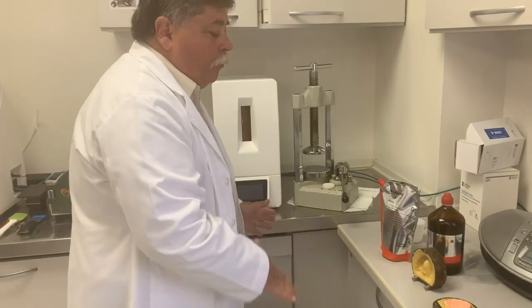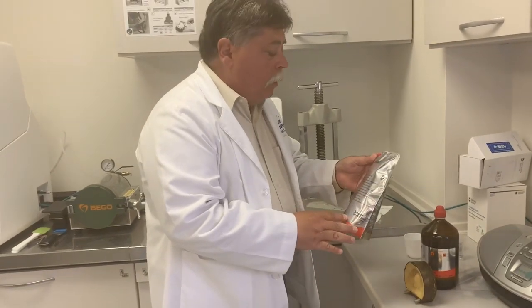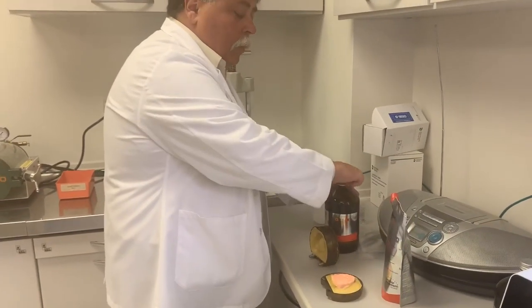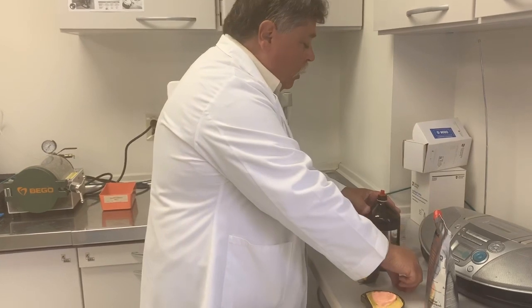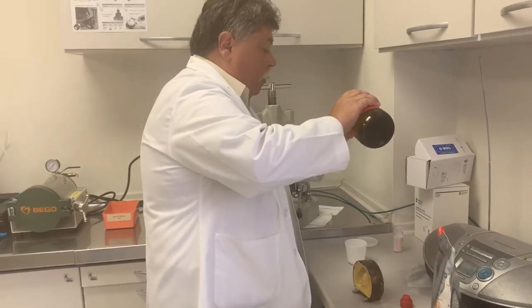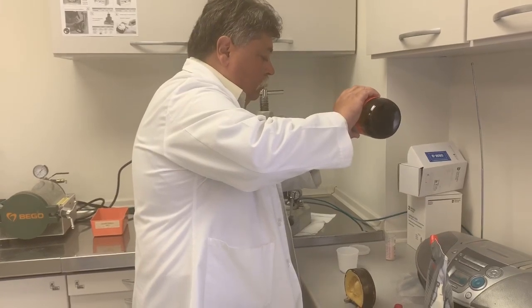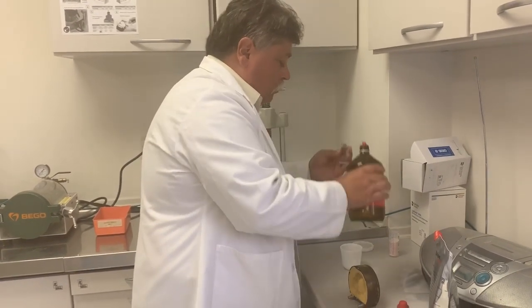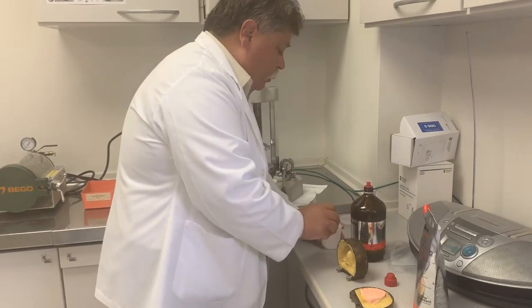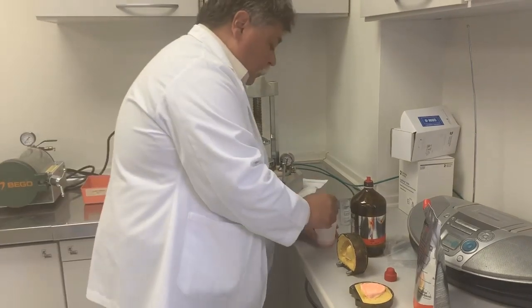All right, now we're ready for our next step. We are going to mix our ProBase Hot, which is a hot cured acrylic. I already have it measured out. It's a two-part system. The powder is called the polymer, and the liquid is called the monomer. I'm going to measure out the proper amount, add our powder into the liquid, and mix.